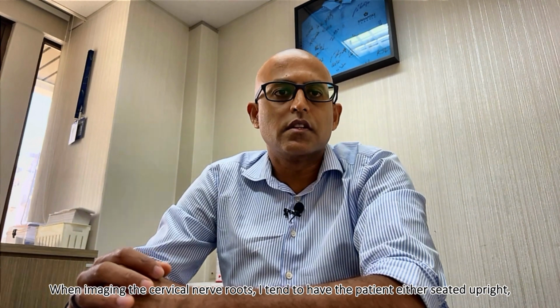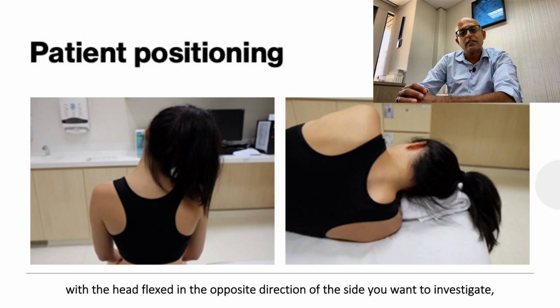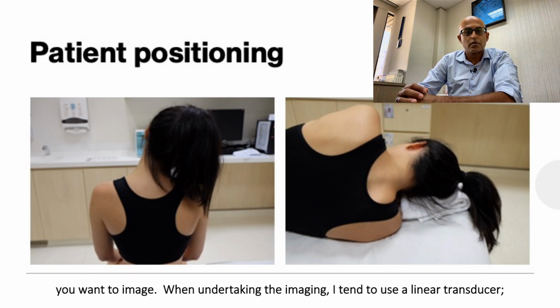When imaging the cervical nerve roots, I tend to have the patient either seated upright, with the head flexed in the opposite direction of the side you want to investigate, or I have them lying down, again with the head flexed in a sideways position so that it exposes the side that you want to image.